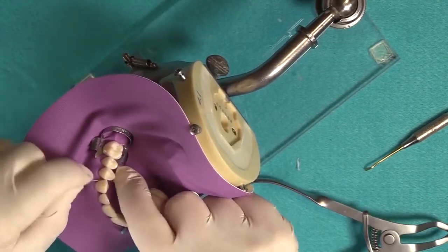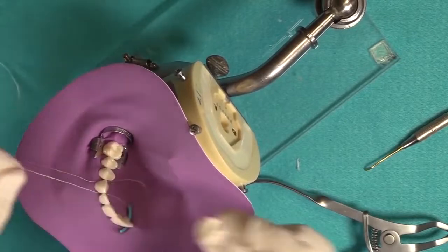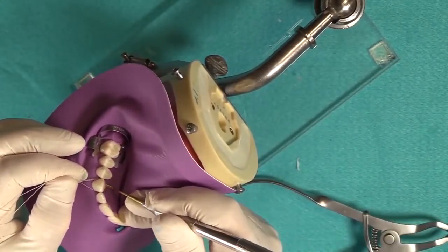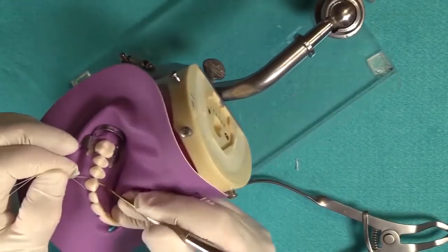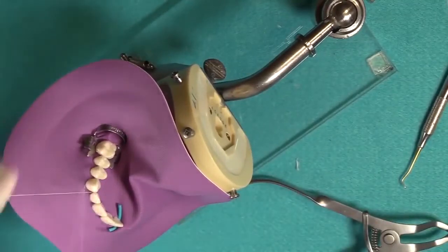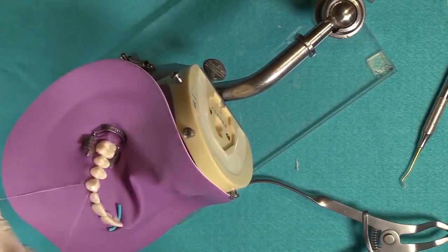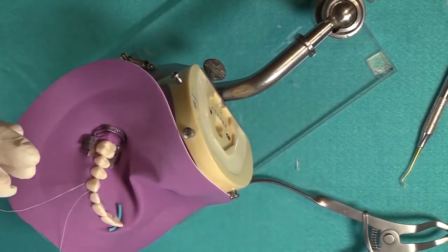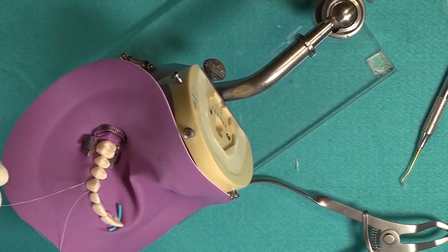Another trick with using floss is to floss the distal, come in and floss the mesial, grab the two ends, take your instrument and tuck the dam and the floss, just like that, and then cross it gently. I do mean gently, you don't want to injure the patient's tissue. This is a very good technique because when you have a class 5, by crossing it, you're drawing it all the way around the tooth. Exactly. To roll it down all the way around.